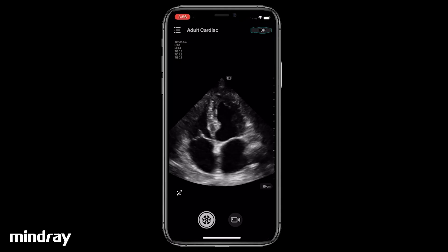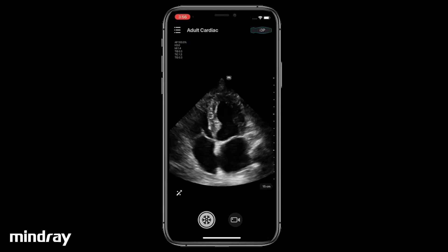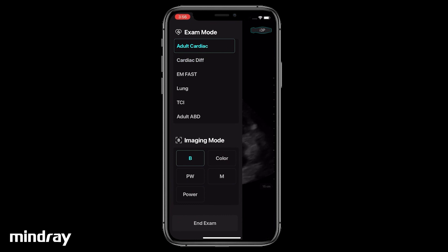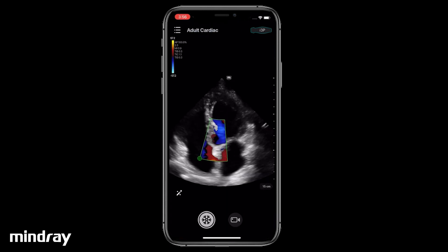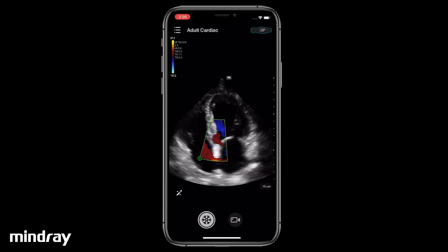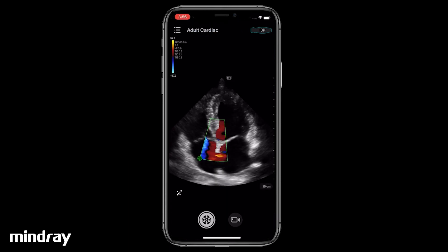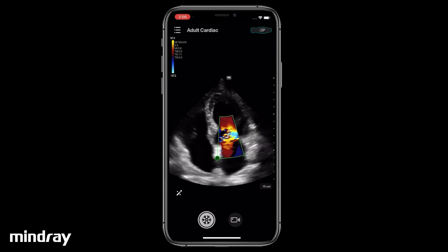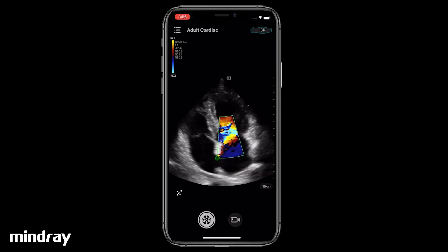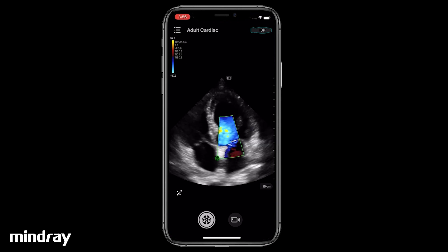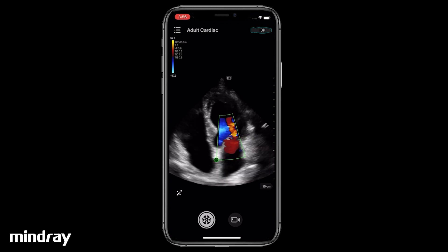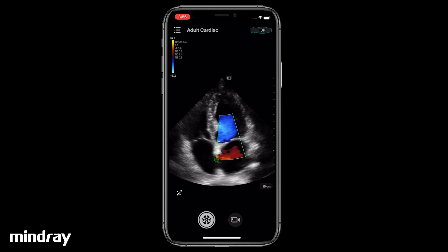Swipe the screen from the left edge to the right, then tap Color. Drag the sample frame to the target position. Drag the direction icon at the lower left corner of the sample frame to resize.